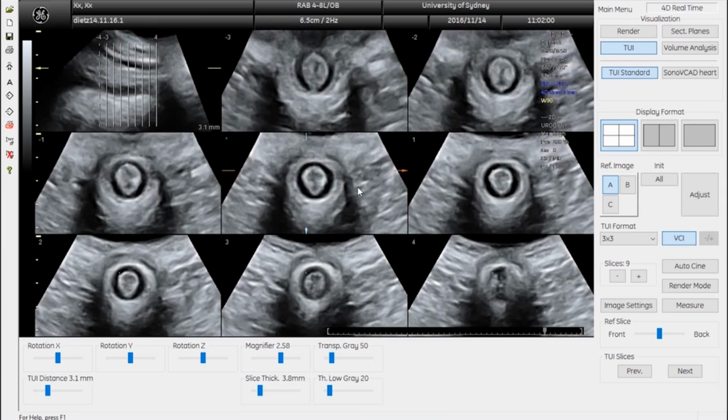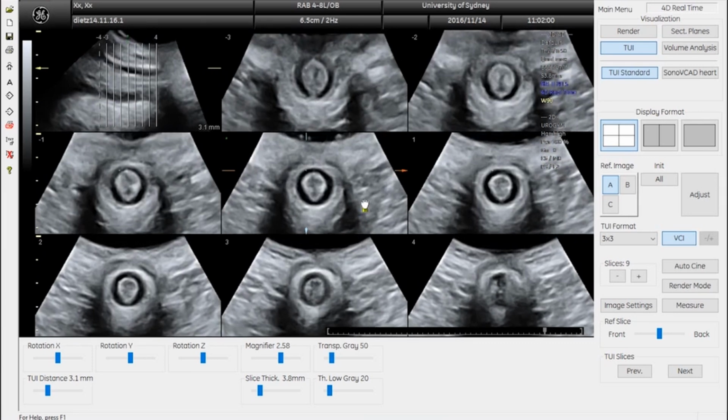And we really normally still want to see the perineum, because who knows what might have happened there. You can see that the distance between the EAS and the surface of the transducer here is about 1 centimeter. That seems to be a really good depth in order to maximize tissue discrimination. And you can see that that sphincter is normal. So the IAS, that dark ring, is normal all the way through. It's beautiful. The bright ring of the EAS is also normal.